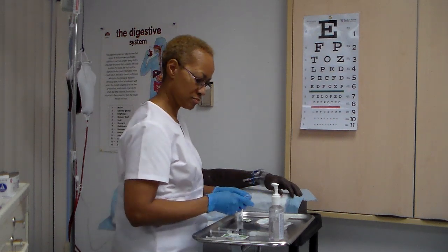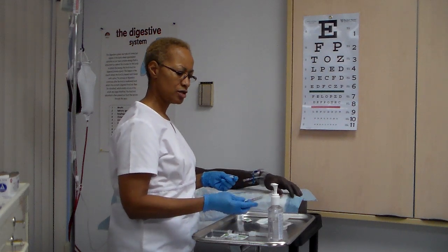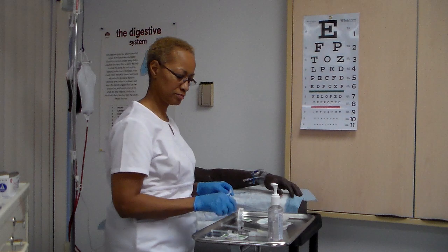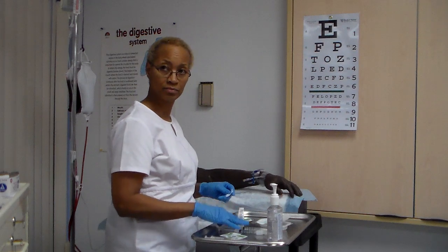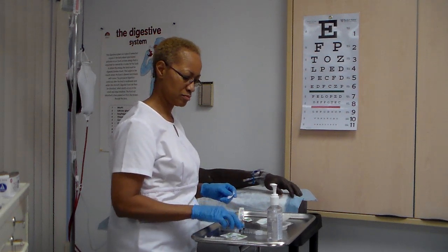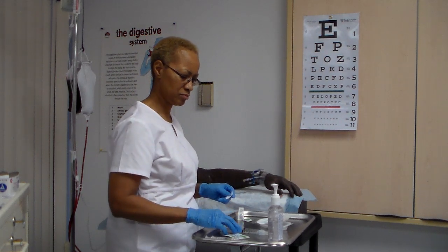Prepare flush solutions according to agency policy. Okay, so I have 2 saline flushes. Saline flush method, preferred method. Prepare 2 syringes with 2 to 3 milliliters of normal saline in syringe. Okay. Heparin flush method is the traditional method. Prepare 1 syringe with ordered amount of heparin flush solution. Prepare 2 syringes with 2 to 3 milliliters of normal saline.